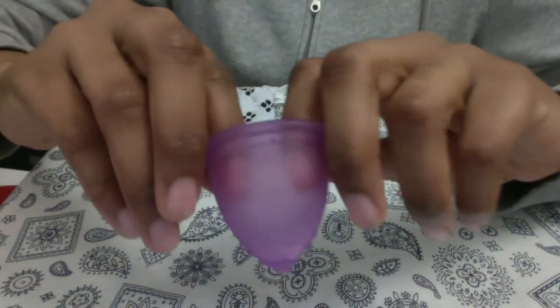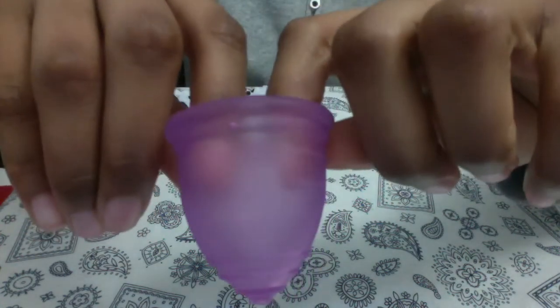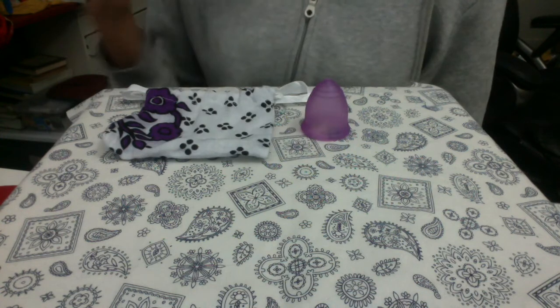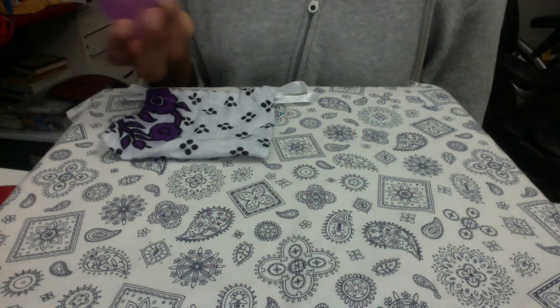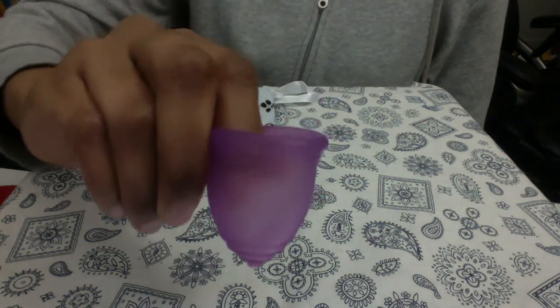And that's because of the one thing I don't like about this cup, which is that the suction release holes are very, very tiny. As you can see there, there are 4 of them and they're very small holes. On my heaviest days, I have to empty my cup sometimes up to 4 times, but definitely at least once while I'm away from home. And I usually don't have running water when I change my cup, especially at the office or if I'm commuting. So having a cup that is easy to clean in that situation is important, and so far I have not been able to clean these release holes without running water.